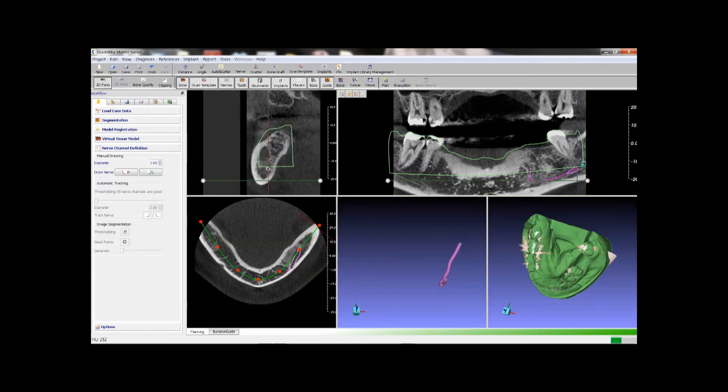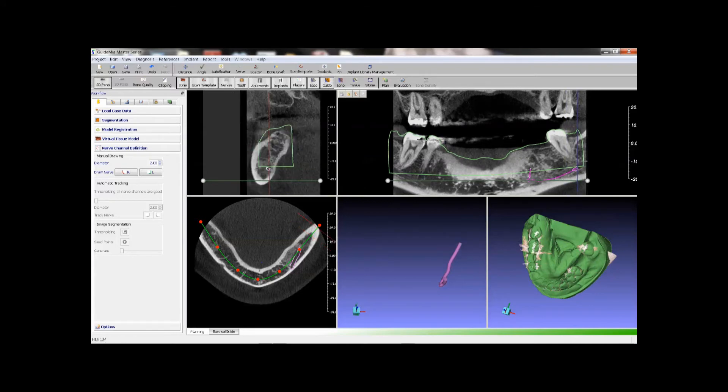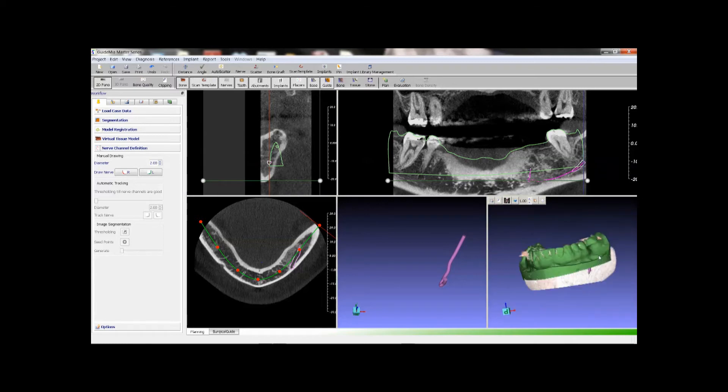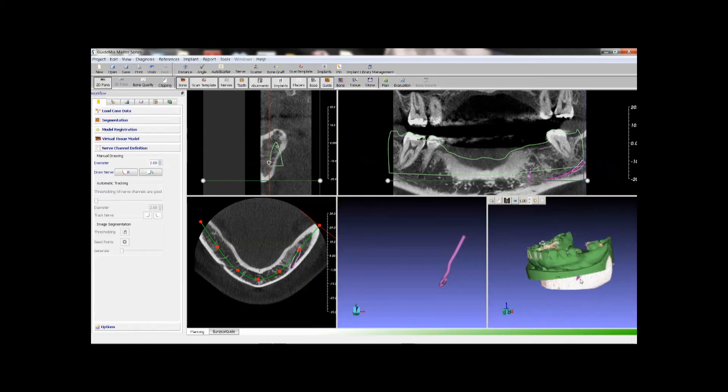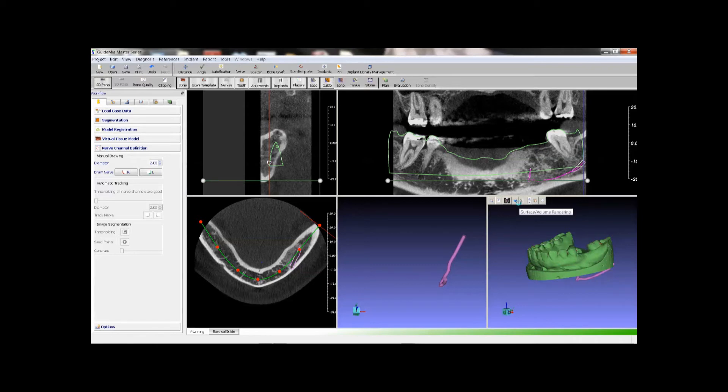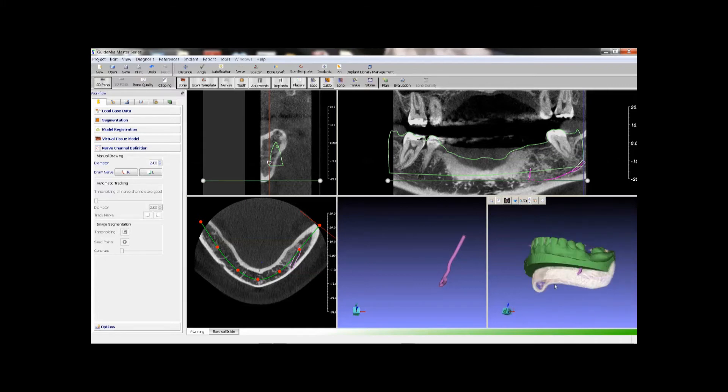Right click to finish this channel. For this case we will only create the left side. Check out the 3D view, give the bone model some transparency. You can see the nerve channel here. Now we are done with the case preparation and ready for implant placement.